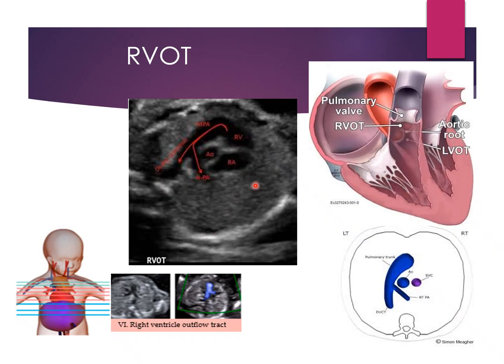And how do we cut that? We are going to cut it so that we are getting this pulmonary artery in the long axis. So we're going to start here, and let's go ahead and draw it out. We're going to cut it down like this.